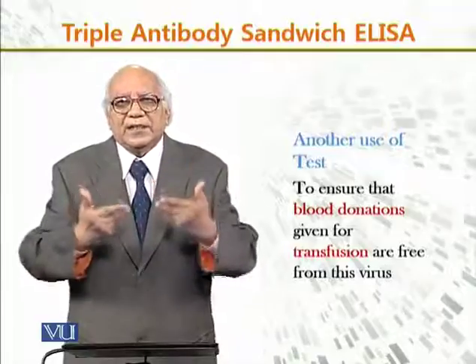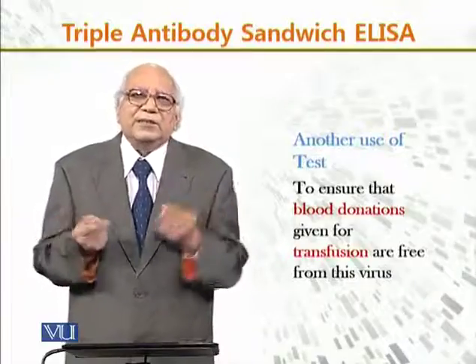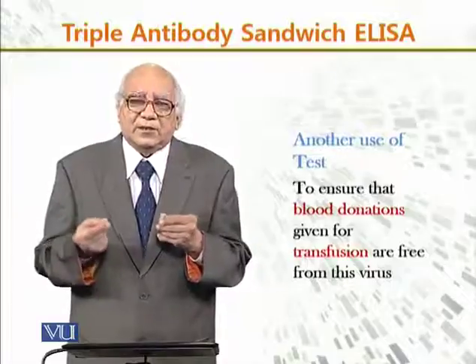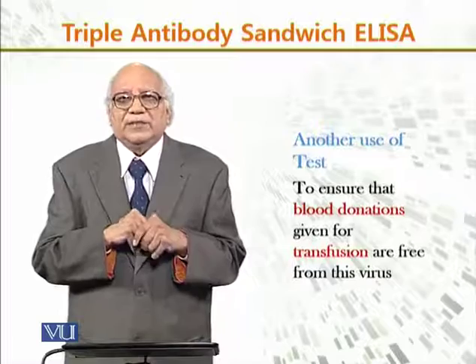So you see that the indirect ELISA method has played a significant role in the diagnosis of HBV and the diagnosis of the HBV tests.